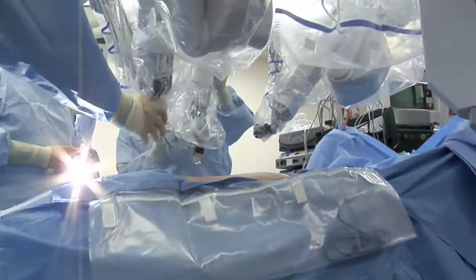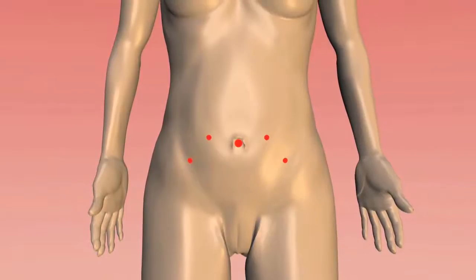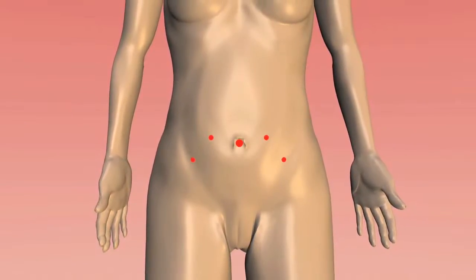For the robotic approach to removal of the ovaries, this entails a few key steps. The first is to access the abdominal cavity through five very small incisions. Two of the incisions are about an inch wide — that's where the camera goes, usually at the level of the belly button or a little bit higher. The second one-inch incision goes just below the rib cage, where the surgical assistant works to remove the ovary or provide suture. There are also three other small incisions, about a half inch in width, where the surgical instrumentation is placed.